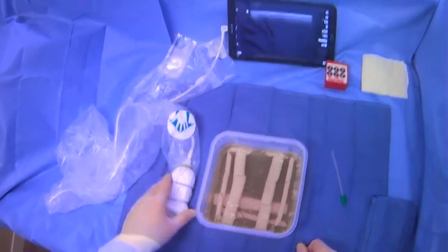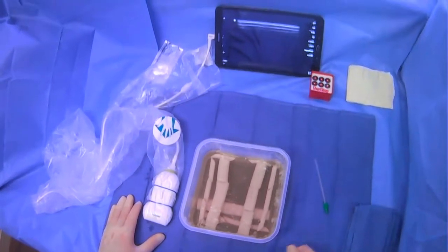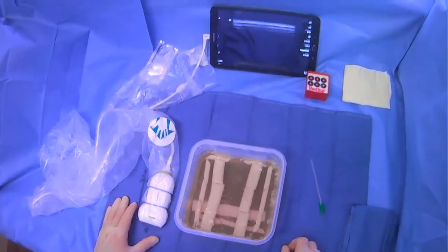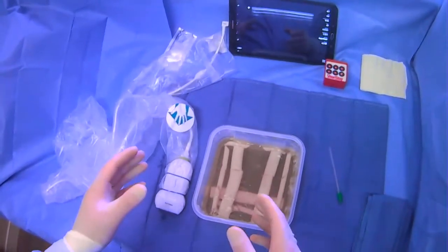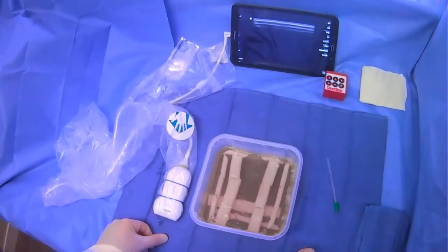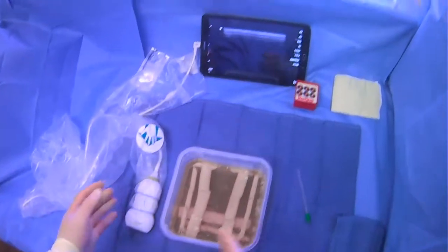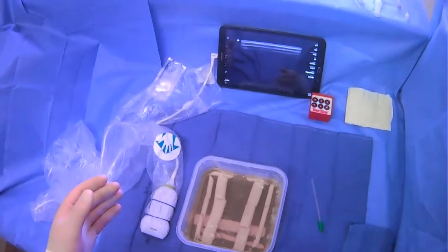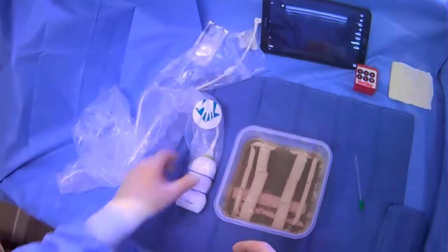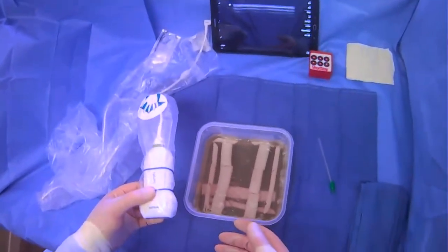I want to go over how to hold the ultrasound probe when you're going to be doing a case which requires you to get IJ access, access into the internal jugular vein. This probe holding is going to be for the gaining of access into the IJ. So it's a simple thing to gain access if you know what you're doing. However, oftentimes people can get tripped up at the start of the case when they're holding the probe in a way that doesn't really set them up for success. So that's why we're going to spend a little bit of time to talk about this. It seems simple, but it does set the tone for the rest of the case.